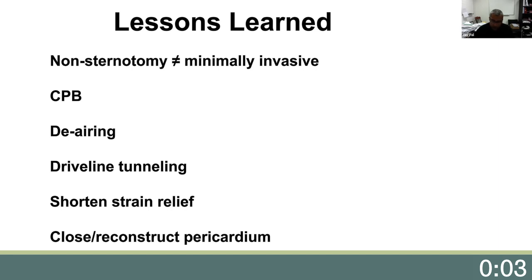All currently approved LVADs include cardiopulmonary bypass in the IFU. Furthermore, this facilitates mobilization of the apex, resection of any trabeculations or ventricular thrombi, and allows for better de-airing maneuvers.